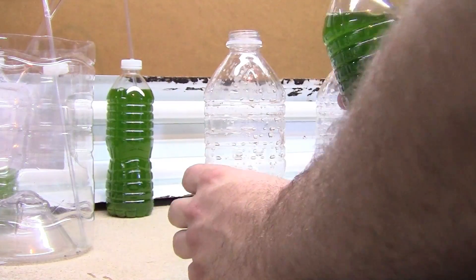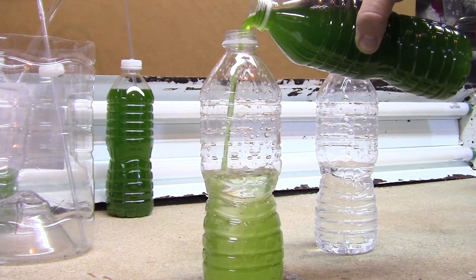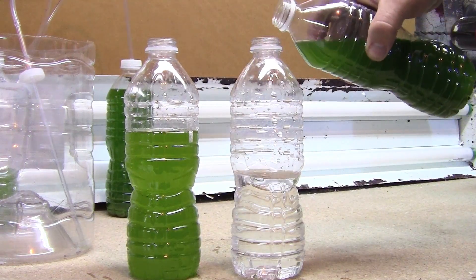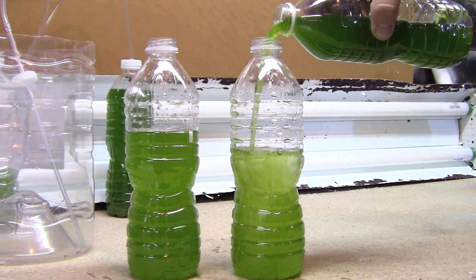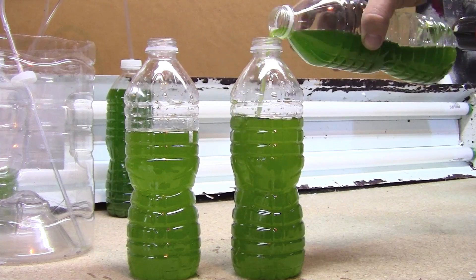I fill the vessels about a third to two thirds with the fresh mixed salt water and then I put in probably about another third of phytoplankton. It's not so much a measurement as it is about the coloration of the water.